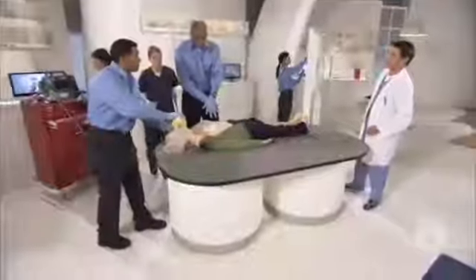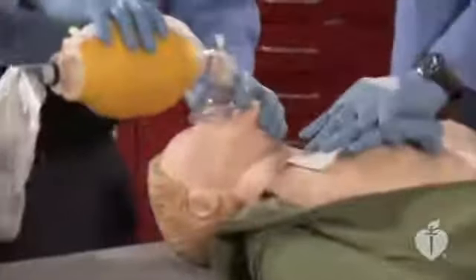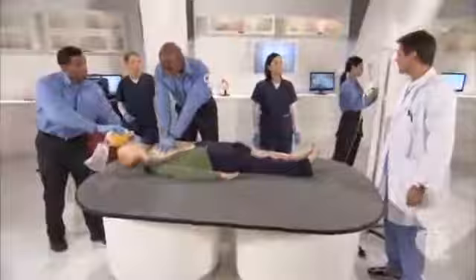Okay, the patient remains in VFib. The protocol for this biphasic device is escalated dosing. Let's shock again at 300 joules. Shocking at 300 joules. Charging. Clear the patient. Shocking on 3. 1, 2, 3. Shocking. Shock delivered. Continue CPR. Continue compressions. Dana, please give 1 milligram of epinephrine. 1 milligram epinephrine. And the IO is flushed.